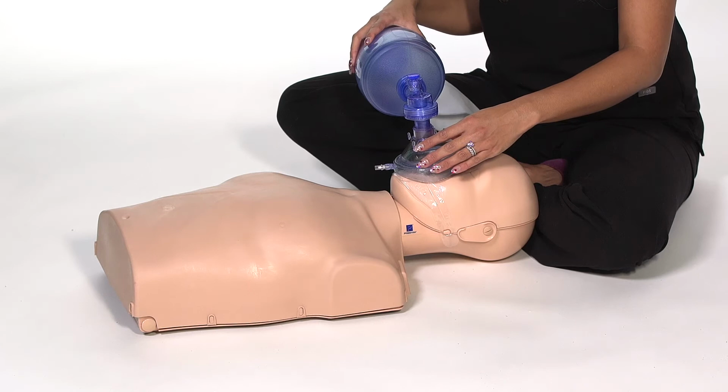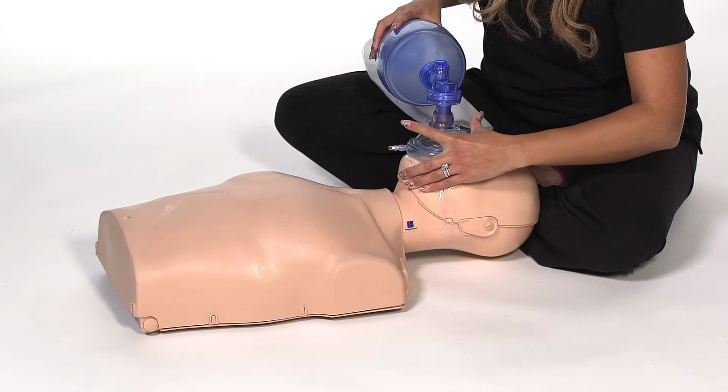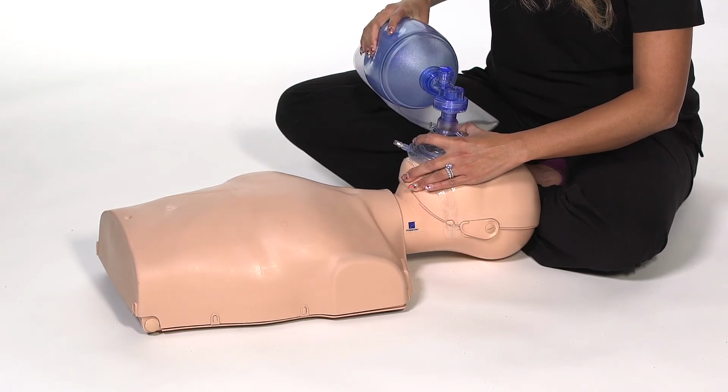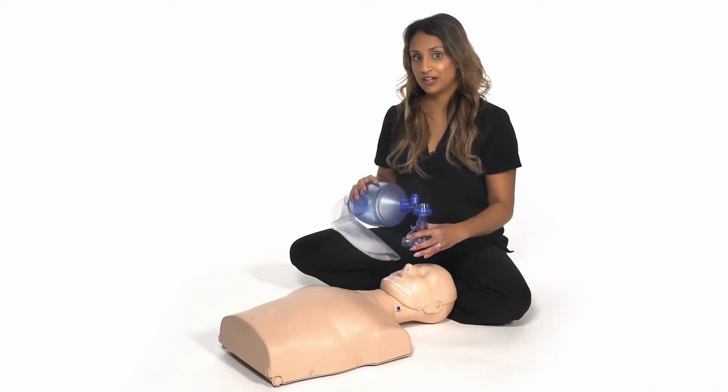We're going to use the EC technique to deliver these breaths. So I'm going to take these three fingers, lift the chin up, make a C with my hands up here. I'm going to give one breath every 6 seconds here, and then watch for chest rise. We don't want to give too much and overventilate the patient.